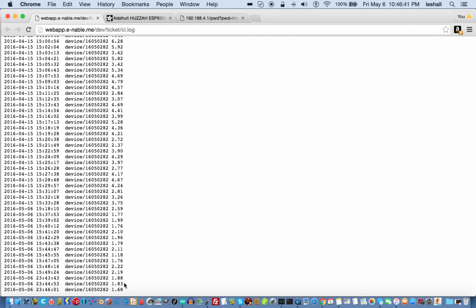Actually, I don't have the resistive divider or anything hooked up to the analog I/O pin, so this is kind of a random number. It's not that random. It's due to the electronics on the thing with the protection diodes and the diode, whatever it is, the diode OR-ing. So anyway, long story short, we are sending data to webapp.e-nable.me, which is our cloud at e-NABLE, and it's appearing in the list here. Ta-da! That's about it.